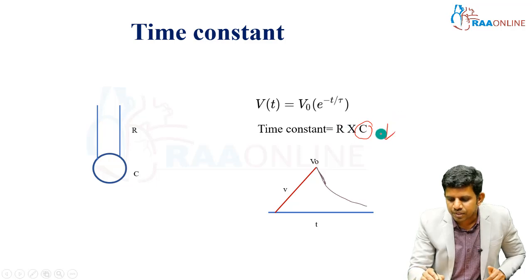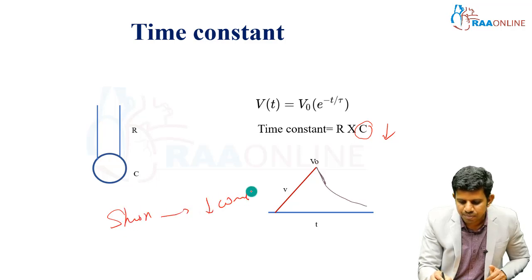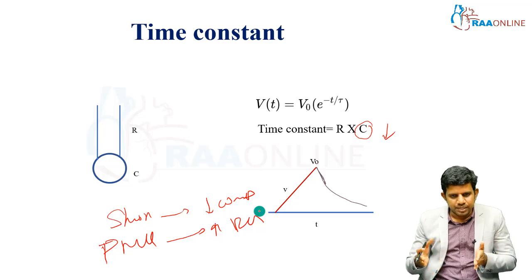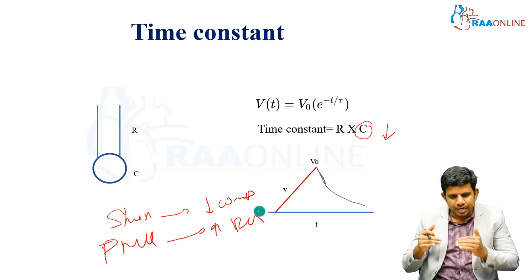So anything with a short time constant is most likely related to decreased compliance. A prolonged time constant means increased resistance, most likely obstructive airway disease. A short time constant most likely means ARDS, pulmonary edema or pneumonia. In all those conditions, compliance will decrease, so time constant will decrease.